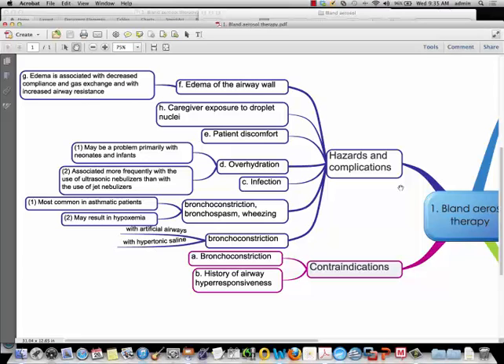Aerosols generated with the ultrasonic system, the aerosol is very dense and has a lot more aerosol in it than your standard pneumatic jet nebulizer. So they produce a lot of aerosol. Ultrasonic systems are used for providing mist for mist tents. When you want to set up a mist tent for a child who has croup and you want it to be a cold mist, use an ultrasonic system. That will really pump out a lot of aerosol and make it very dense, a cool, dense aerosol to help treat croup, for example.